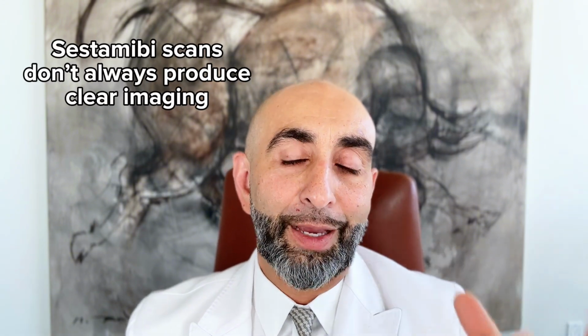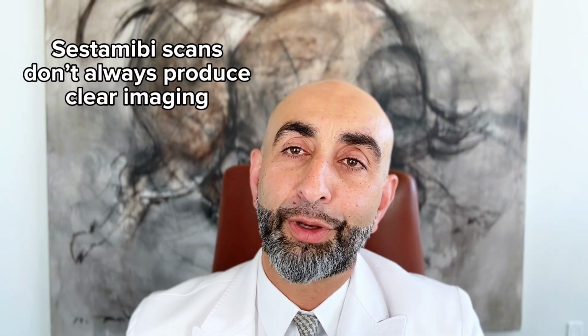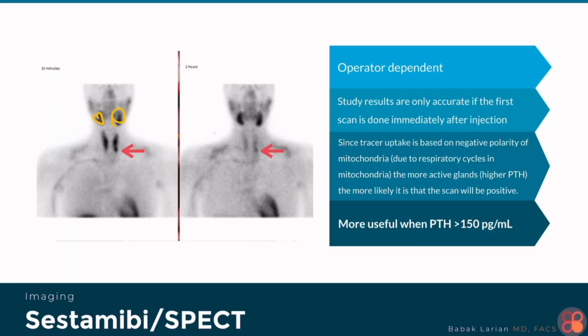And the problem with it is that this scan is looking at the mitochondria or the factory of the cells that are overworking, right? So the thyroid is working a lot and the saliva glands are doing it, the heart is doing it, and so on, right? Other tissues can be overworking and masquerade as the parathyroid on this. So it's not specific for parathyroid, it's specific for the factory, the engine of the cell, right?